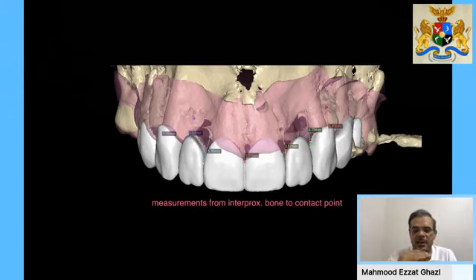It needs to, so that the demarcation between the prosthesis, the pink, and the patient's gingiva that's already there is hidden beneath the patient's upper lip. So the implant will be placed at a higher level. The distribution of the implants would be totally different because we would go for a hybrid prosthesis.